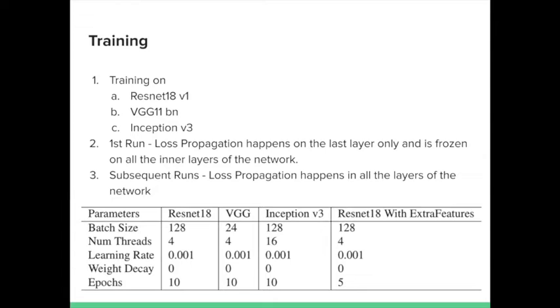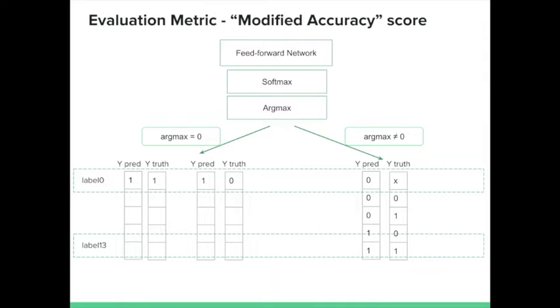So such a training needs to have a robust performance evaluation method. While research papers in our background study mentioned ROC-AUC curve, F1 score, precision and recall, we explored the possibility of coming up with our own version of evaluation that was used alongside the ROC-AUC scores. The intuition behind coming up with this was because this problem had 14 classes, and there is a non-negligible probability of more than one class being correct. So the existing metrics don't quite capture this. It is ultimately a multi-label, multi-class classification problem. And the caveat here is that some labels are mutually exclusive. For example, no disease versus diseases like pneumonia. That is, they cannot coexist.